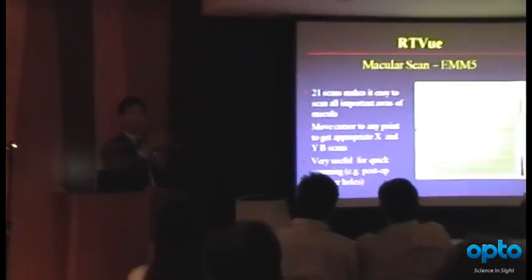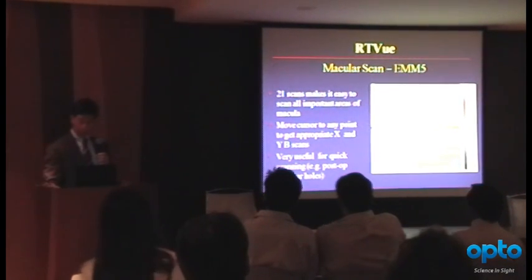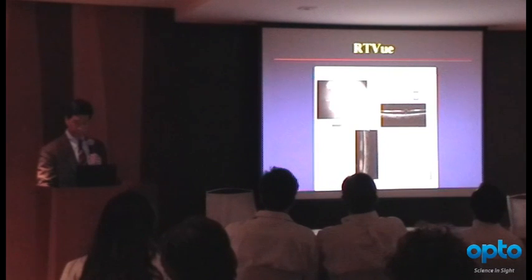If you want to go from any of these scans, in other words, if you want to see all of them or a few of them, instead of just getting your imager or your photographer to give you a printout, you can go right to the machine, and this video will run. Now, unfortunately, it doesn't look like my video is running, but you can move the cursor into any of those scans.